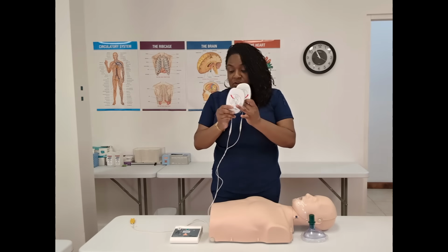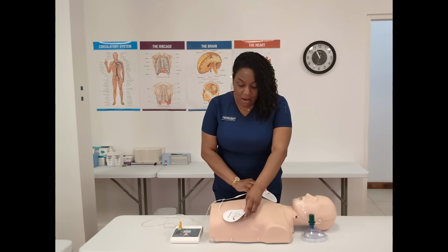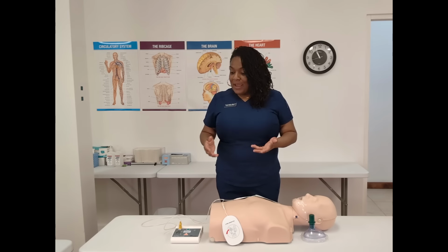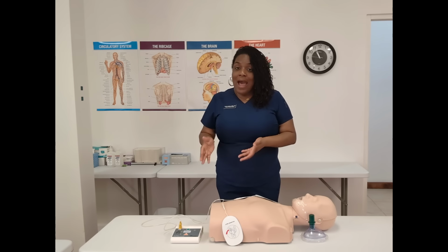After we apply the pads, peel and stick, it is going to tell us to connect it. You have to learn how to use your AED because some models operate differently. Once we connect it, it is going to say, analyzing heart rhythm, do not touch the victim. And I want you to make sure that no one's touching. You're going to make sure that everybody's clear. I am not preparing you to work as part of a multi-rescuer team. I want you to use this AED exactly as it states.